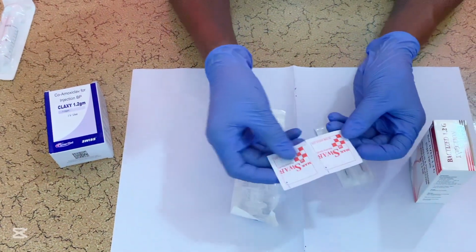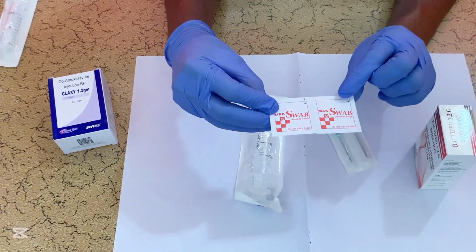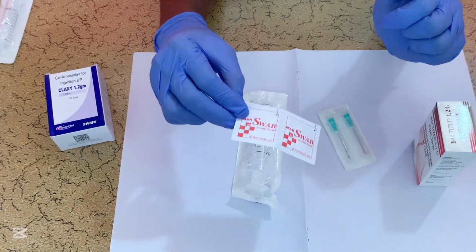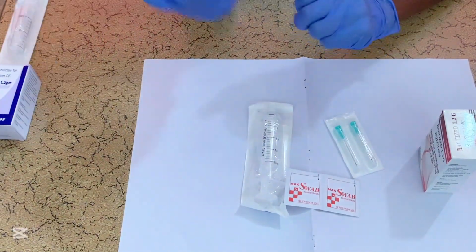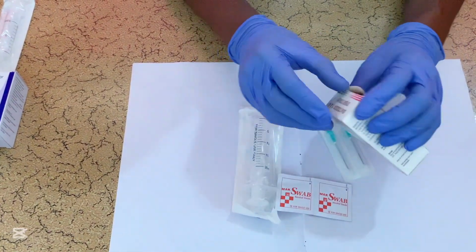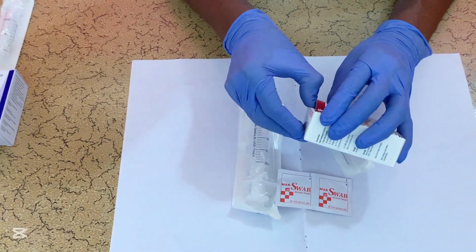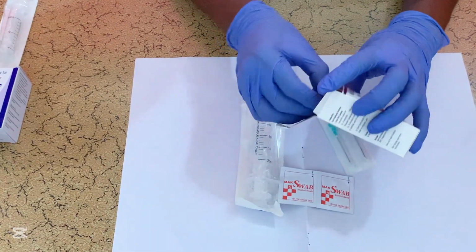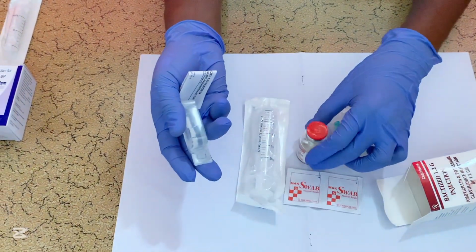You will also need alcohol swabs, with which you will clean the opening of the vial before you start diluting the drug. Okay, let us start. Now let us see a brief overview of the amoxiclav. Make sure you open the packaging of the drug. So this is amoxiclav.